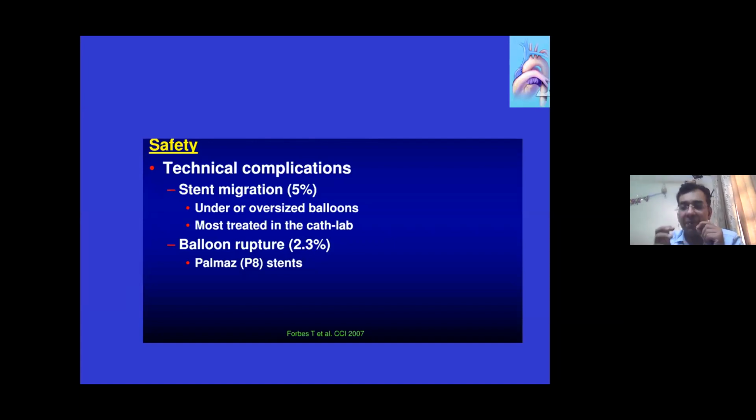can easily slip. Like in our particular case, the stent looked perfectly well if I was looking at an LAO position. When I took a contralateral RAO position, I could clearly see that my stent was not appropriately placed. And this was essentially because of the malalignment. So it's always a good idea to have at least two views, maybe LAO and RAO, two complementary views, to decide before you really deploy the stent.